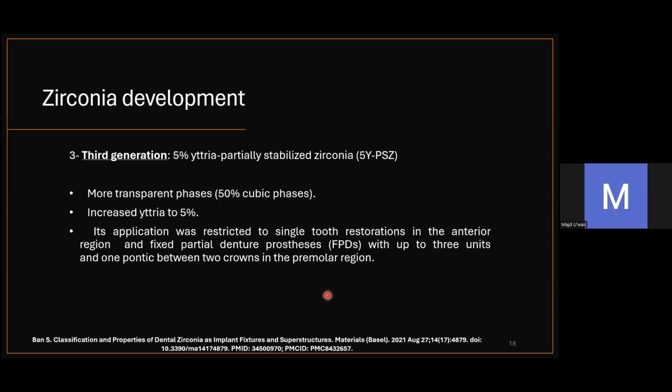Next, the third generation. The next stage in development of zirconia was the inclusion of the transparent phases, which are the cubic phases.